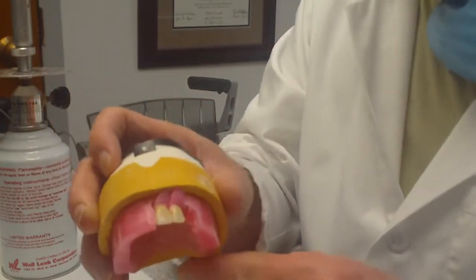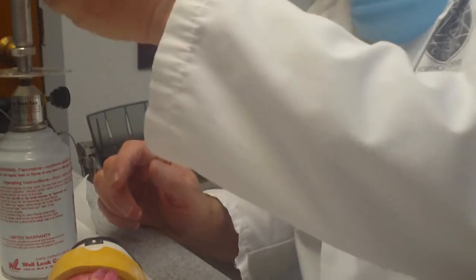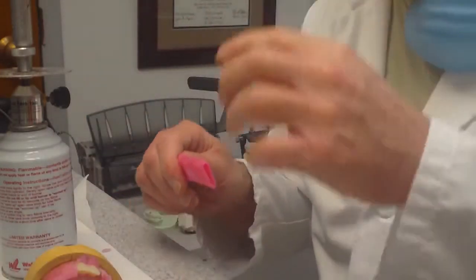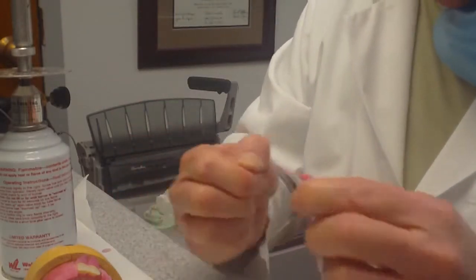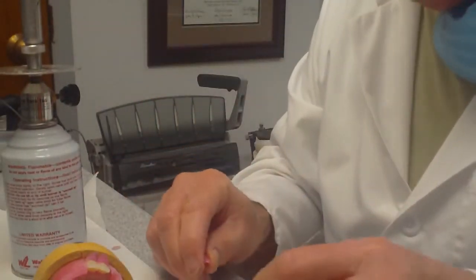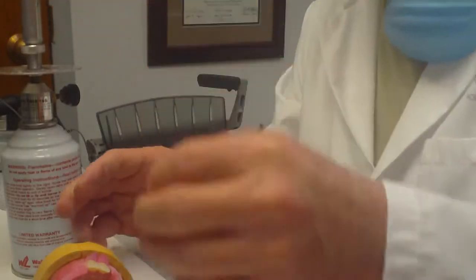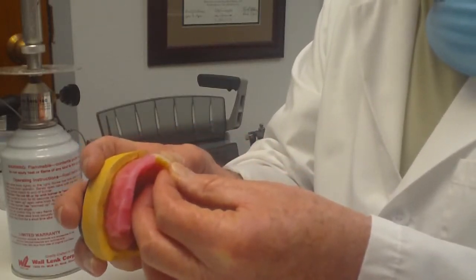So again, same process. Make a tail or wax root and position the tooth. I think I removed enough of the wax rim that I'll probably be able to get the tooth to seat in place. Sometimes if you don't trim back enough, you have to trim the wax rim back a little bit more. Again, it's not a big deal because we're trying to duplicate some symmetry with the opposite side, and so we leave the opposite side intact. So let's go ahead and see if we can get this canine set in the right position and take it from there.